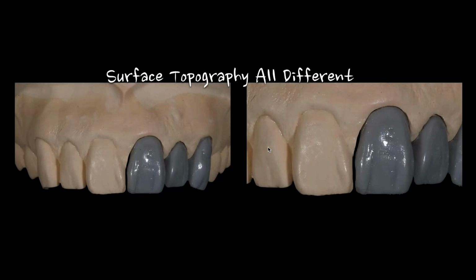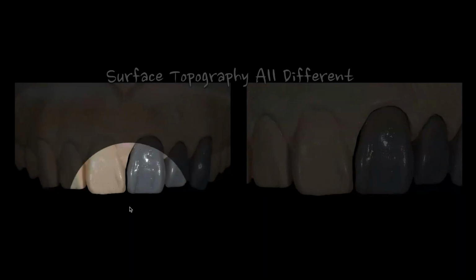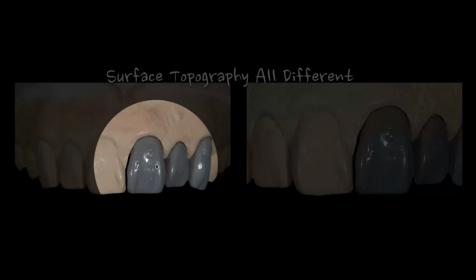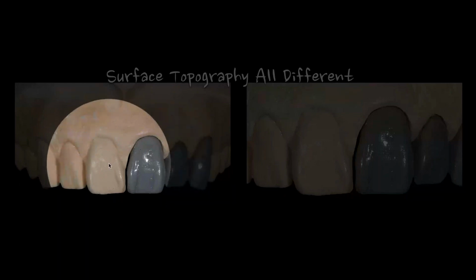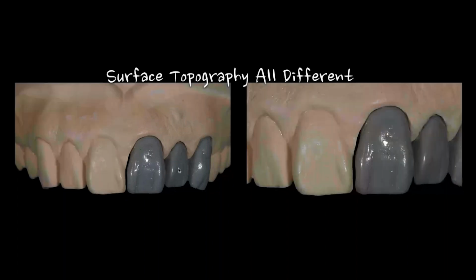Okay, so let's look at some surface topography. This is funny because this was a case I did so long ago, and I happened to find the models, and I grabbed them and took a picture of them. What's really interesting is that even in my wax up, I really have the details that I see on the stone model. And what do I mean by that? You can see in stone, obviously light doesn't reflect as well on stone, but you can see that the light on my wax up has a very similar reflectance to the light on the stone model. And that's really critical for us when we're looking at the shape.